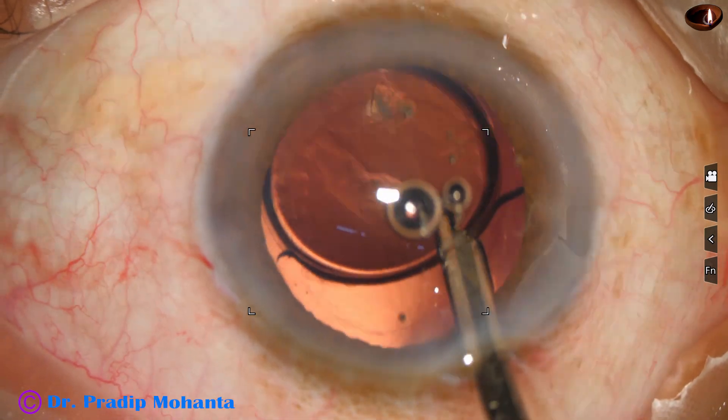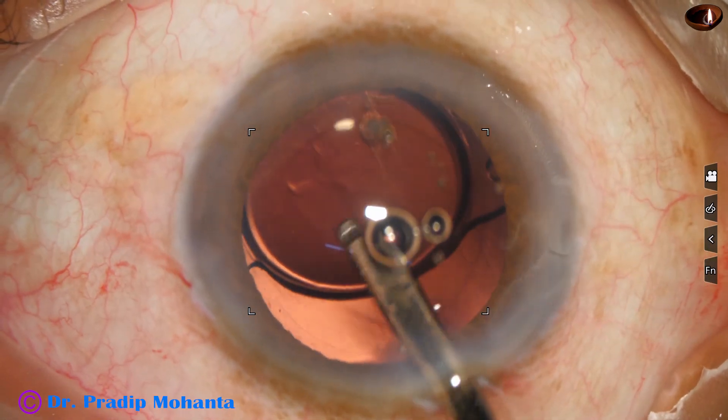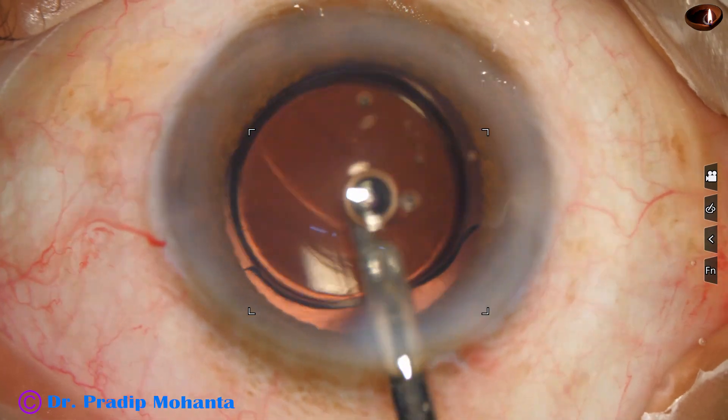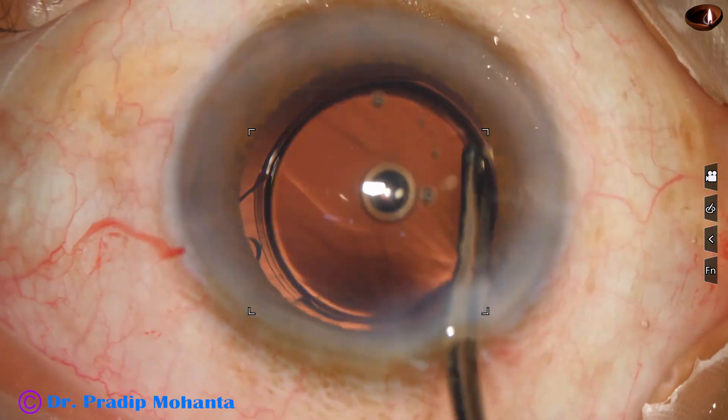And now I go behind the intraocular lens and irrigate BSS into the capsular bag, and thus all the visco from behind the lens is removed.